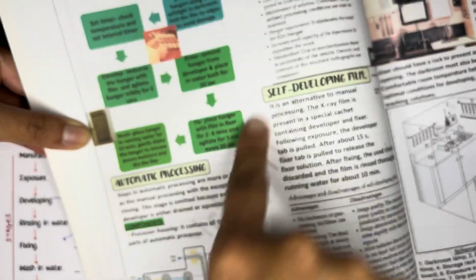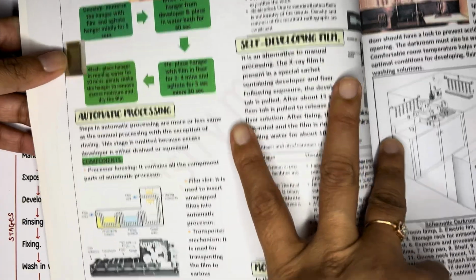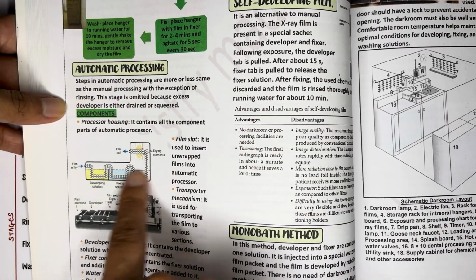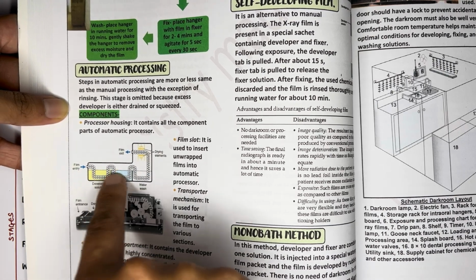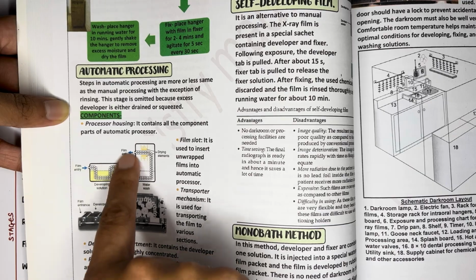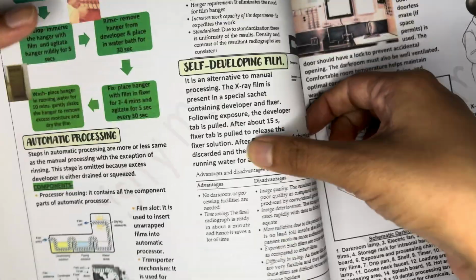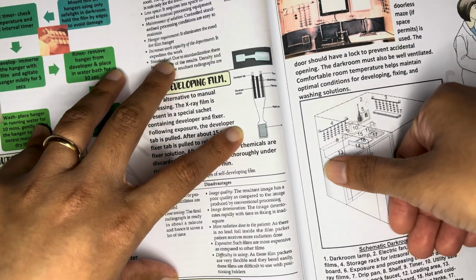These steps I'm going to explain, or show you practically how we are doing it. This is the unit that I was talking about for automatic processing. This is the machine. You just insert your film over here, and it itself goes into the developer, then into the fixer, and you get the complete final image through this film exit. So this is the automatic processing unit. And this is how the film sachet looks like for the self-developing film.